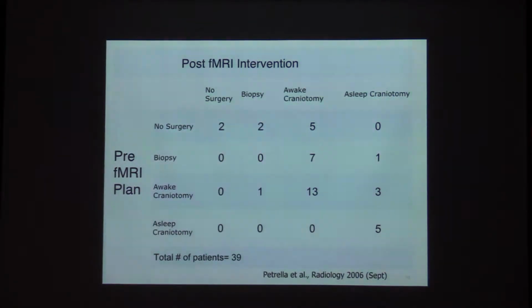And Dr. Petrella, who was once my former mentor, he had this really nice study in radiology saying that fMRI actually changes clinical management because in some cases where this pre-fMRI plan, the important thing here is no surgery. So they initially tried to figure out, based on the MRI, would the surgeon do anything?